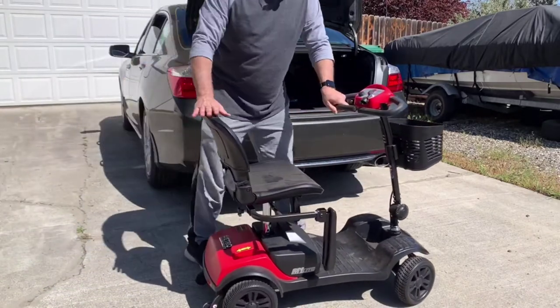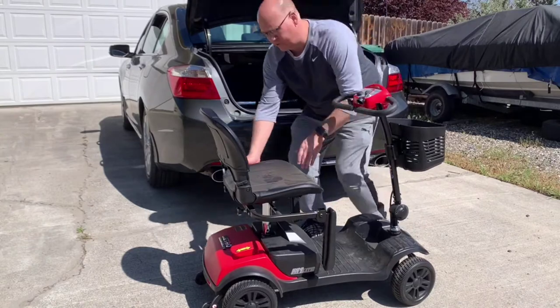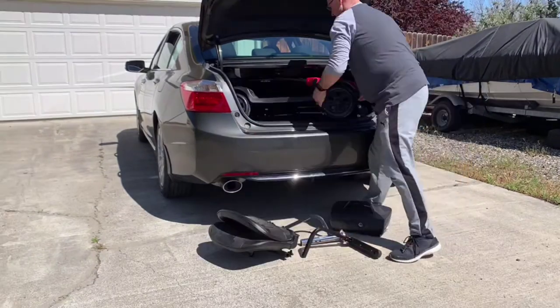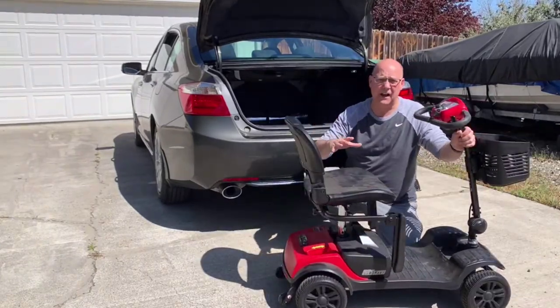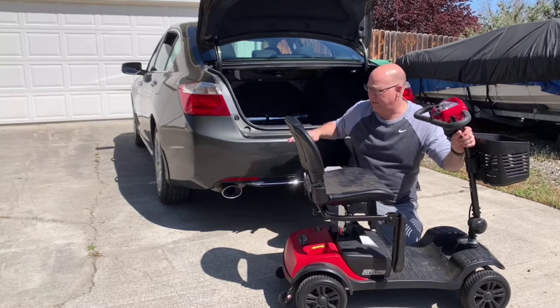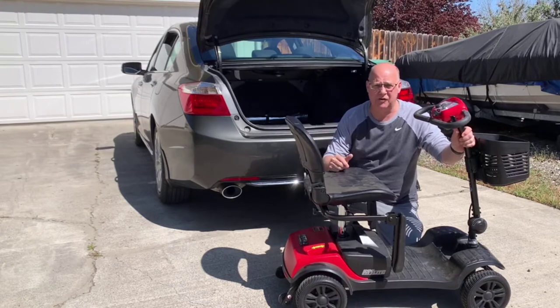One of the reasons we got this MetroCart is because it's so easy to assemble and take apart. When we're traveling, we can just take it apart to put it into the trunk. You saw how quickly I was able to get it out of the trunk. That's one of the things I like about this — you can take it with you on travel without having to have a big trailer.